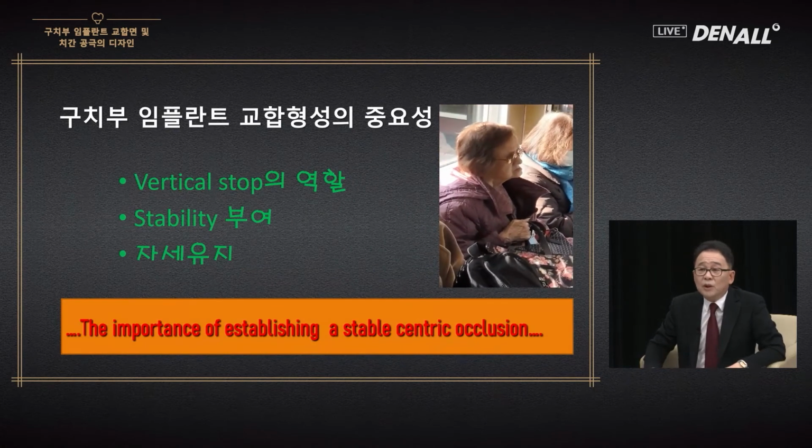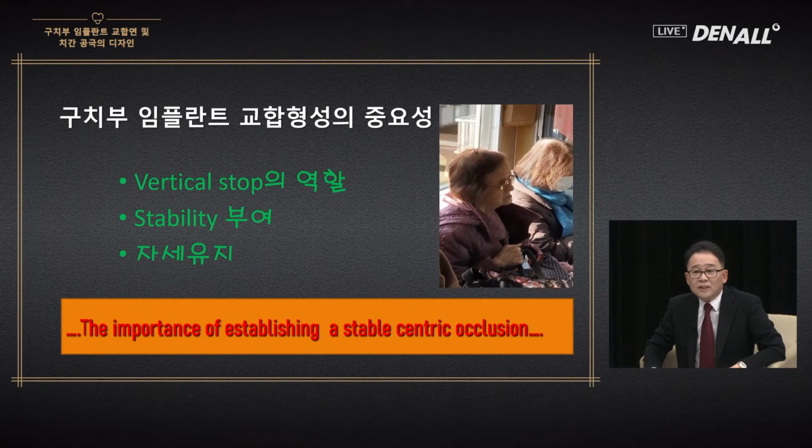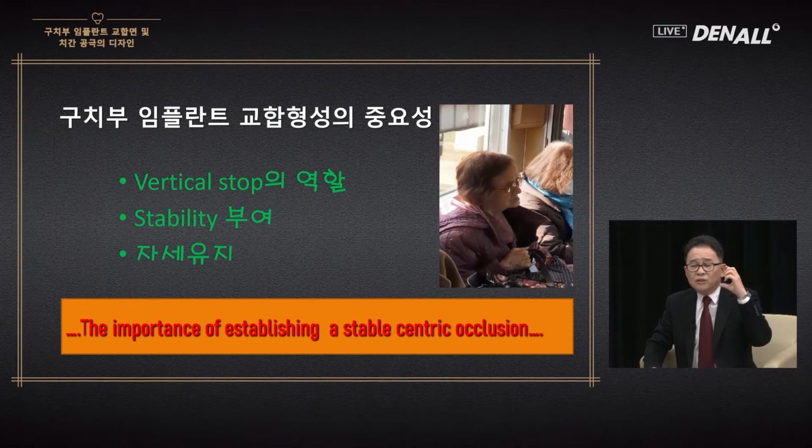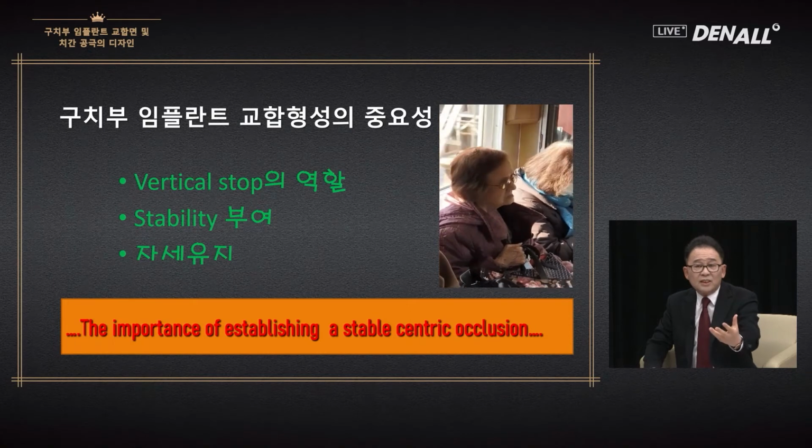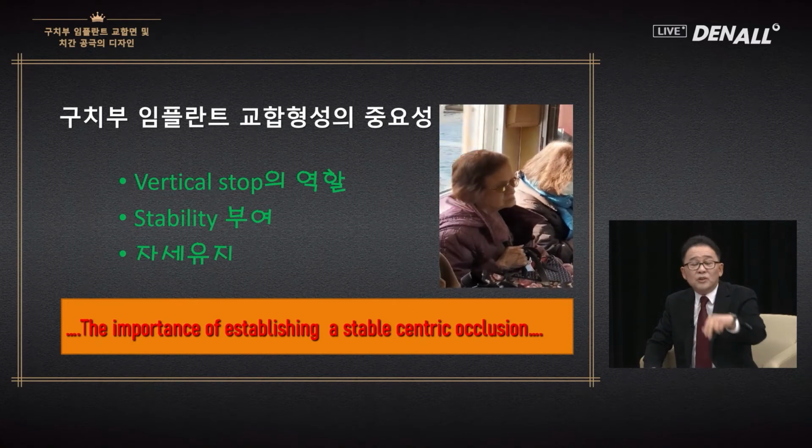The importance of providing posterior implant occlusion, the important thing is to establish a stable centric occlusion. It is very important for these three factors.